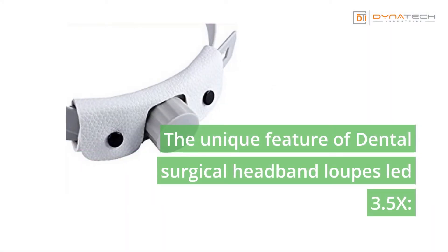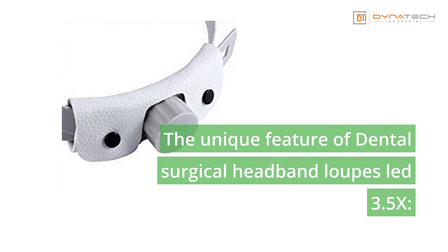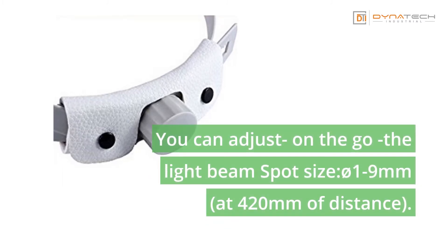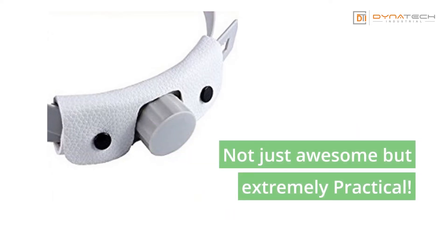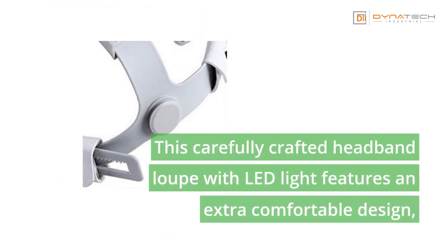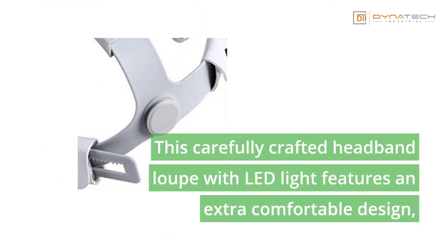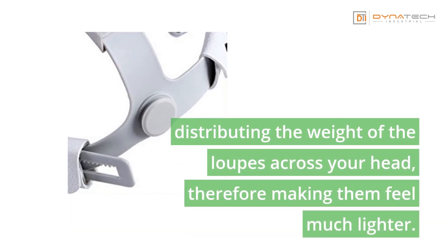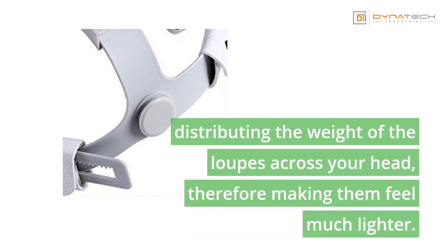A unique feature of the dental surgical headband loupes LED 3.5X is that you can adjust the light beam spot size on the go — 1 to 9 millimeters at 420 millimeters of distance. Not just awesome but extremely practical, this carefully crafted headband loupe with LED light features an extra comfortable design, distributing the weight of the loupes across your head, making them feel much lighter.